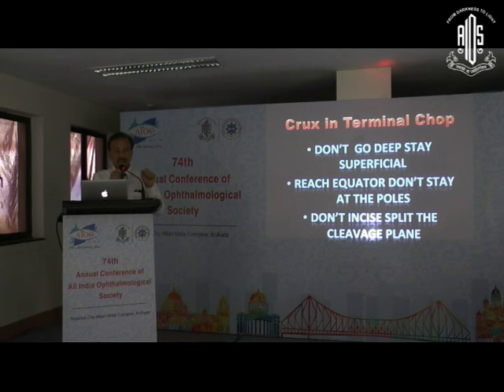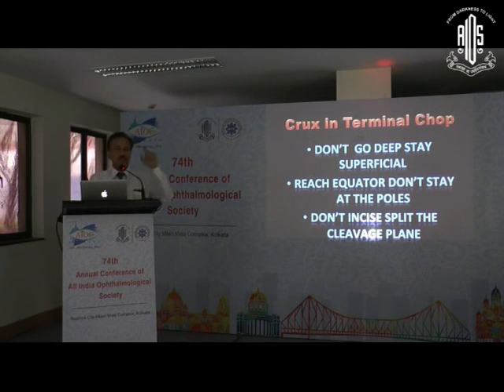dangerous to the posterior capsule, because with your phaco probe, you do not know how deep you have to go. People have devised the Kaddick chop and all these things so that you don't go very deep into the nucleus. But here in this technique, you don't have to go deep. You have to stay superficial. So there is no worry about the posterior capsule because your probe is superficial, and your chopper is blunt. You're not using a sharp chopper. It's an olive tip blunt chopper, which you engage at the periphery of the nucleus. You are not engaging the posterior capsule.